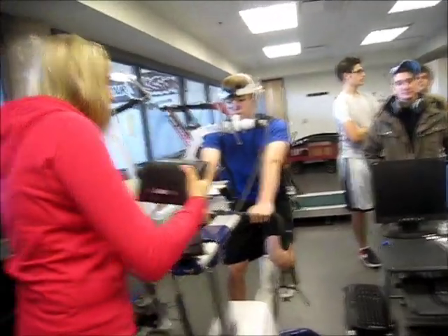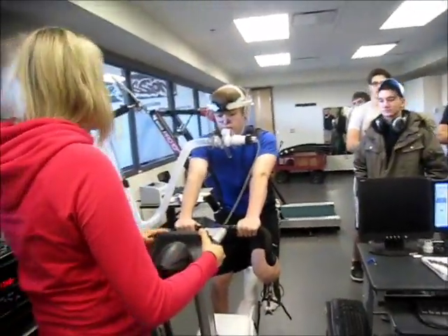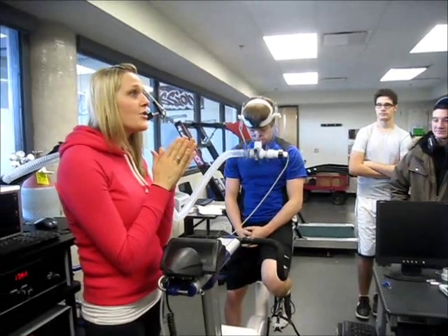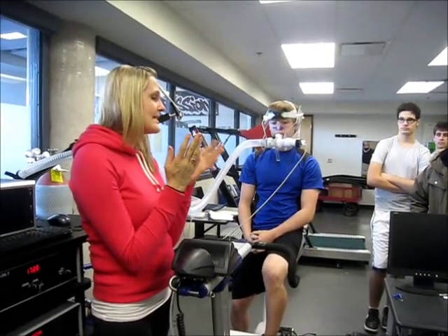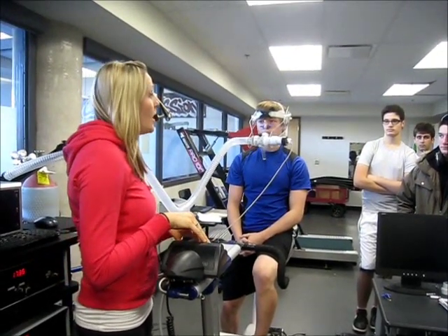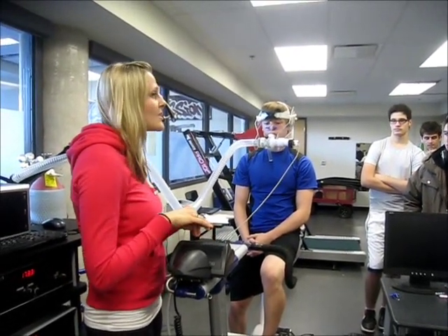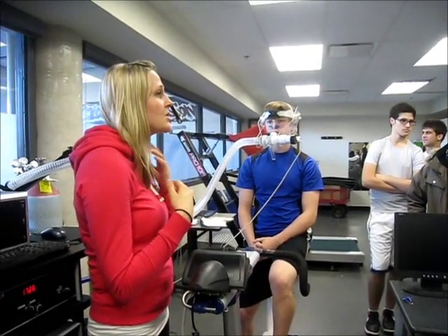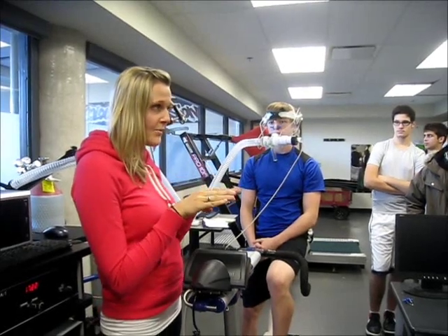Okay guys, so the way this test works — I'll explain it to Daniel so he knows, but you all can listen. As you saw on that graph, the workload's just going to get progressively more difficult. It'll last anywhere between 6 and 12 minutes, depending on the individual. It's going to start at 50 watts — that's the resistance on the bike — so it's pretty much a built-in warm-up. It'll be like that for 2 minutes, a nice comfortable pace, to allow him to warm up and move his muscles.